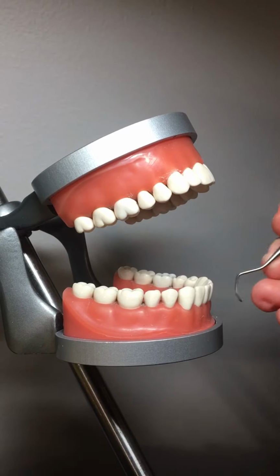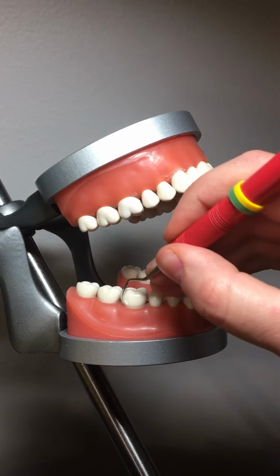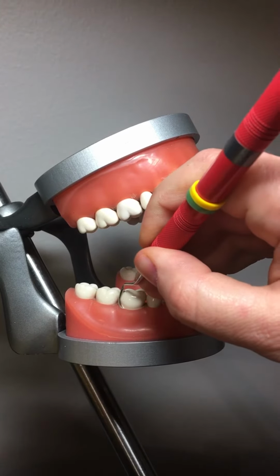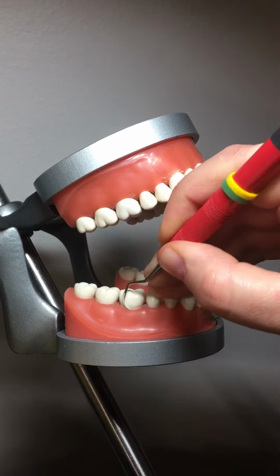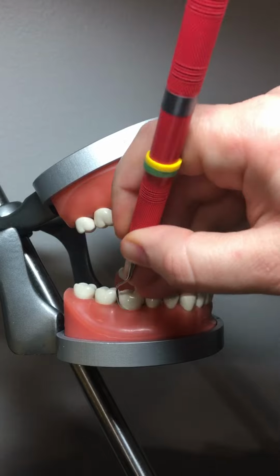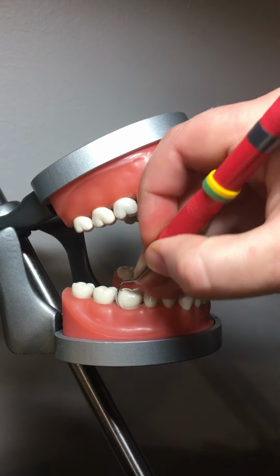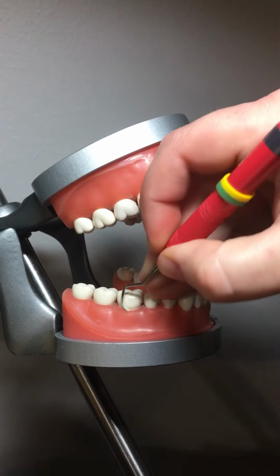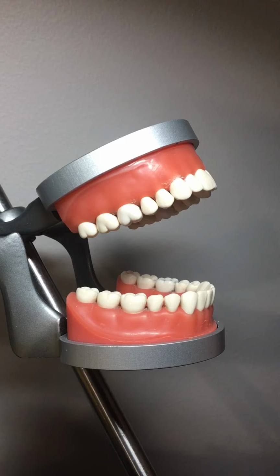The third common calculus removal stroke we use is an oblique stroke. So you're gonna start and you're gonna go across the tooth in an oblique motion. So here is the oblique stroke. So we have vertical, horizontal, and oblique. Those are the three commonly used calculus removal strokes.